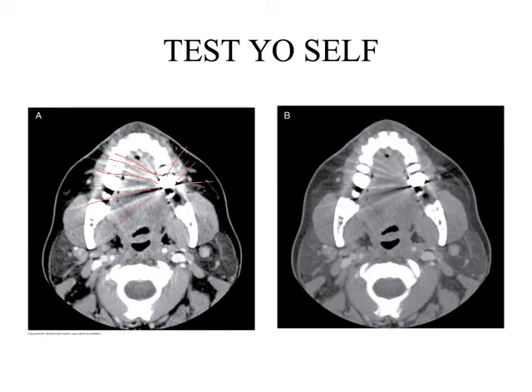Yes, this is their bling, and it's blinging out my image too. So what I've done was I've just increased the window width in order to decrease that contrast brought on by that artifact. But I liked your reasoning, yeah.